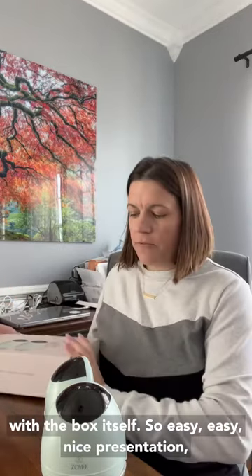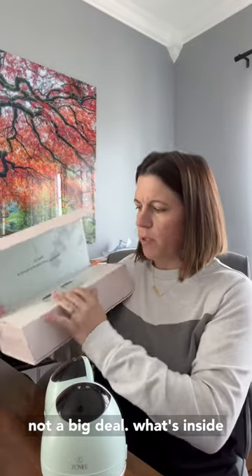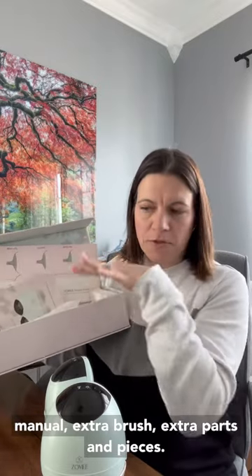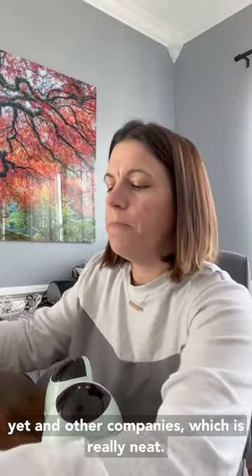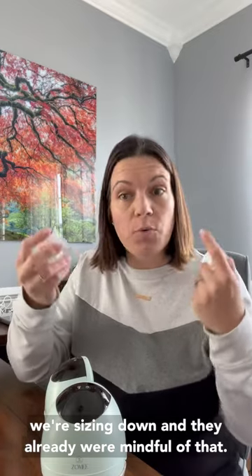Let's start with the box itself. Easy, nice presentation — not a big deal. What's inside really matters. It comes with a sizing tool, manual, extra brush, extra parts and pieces. One thing that Zomi Fit does that I have not seen yet in other companies, which is really neat — it comes with inserts. Generally speaking, you get your pump and you're either a 24, 27, or 28. How many times are you really a 27 or 28? Generally we're sizing down, and they were already mindful of that. So we've got 21s and 17s, which is really excellent — you have to give them credit for that.